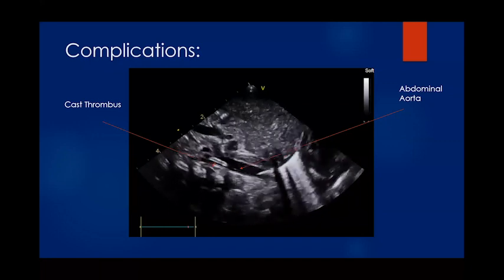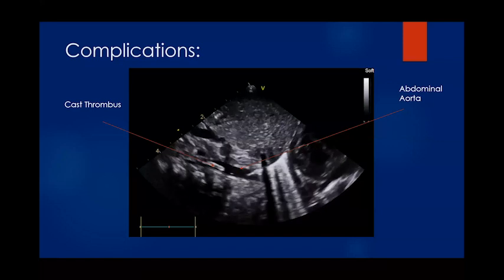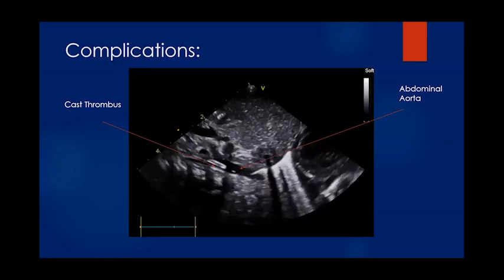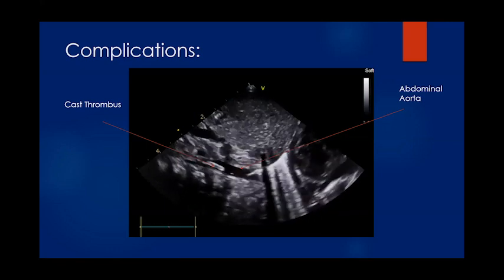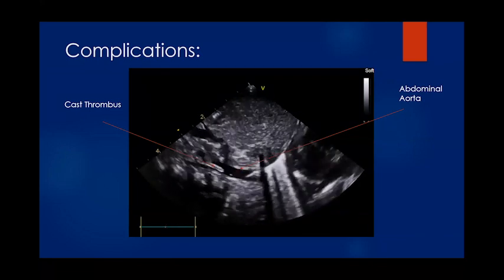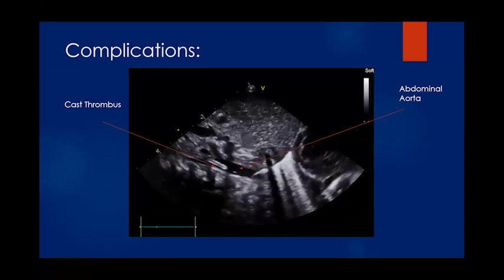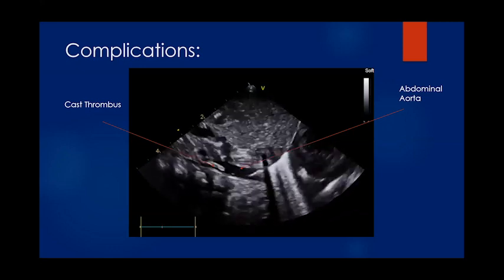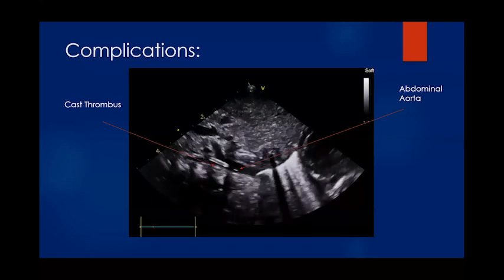And this is because of the UAC. So this patient ended up being started on low molecular weight heparin and was discharged on it and was under follow-up with hematology with frequent ultrasound. Now, if we really did not pick this up, this might turn into a completely occlusive thrombus in the future. Also, this can be a very injured or unhealthy part of the aorta that can be a focus for, for example, an aneurysm. So it's very important to look at those subtle complications.